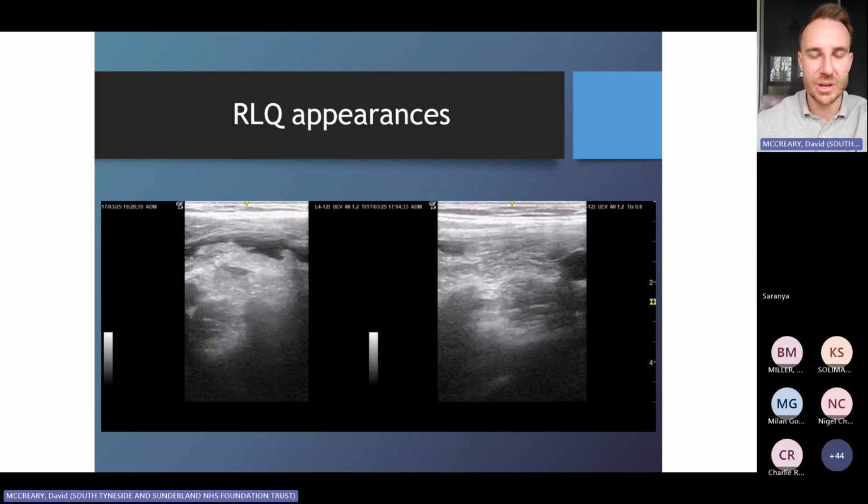So put your probe in the right lower quadrant. You get a bit of a feel based on how tender the child is and what else is going on, how worried you need to be. Does that make sense?